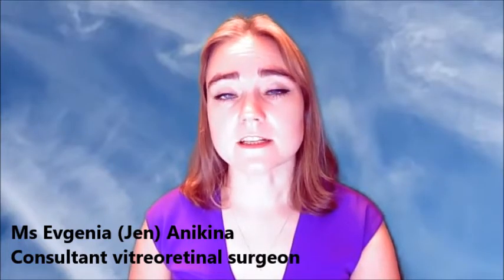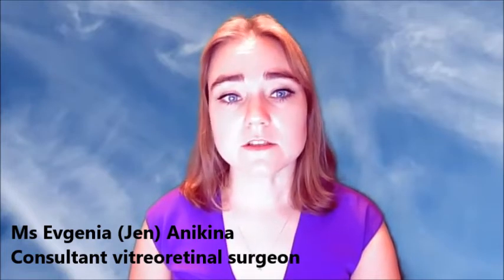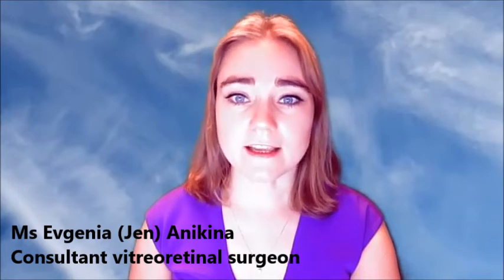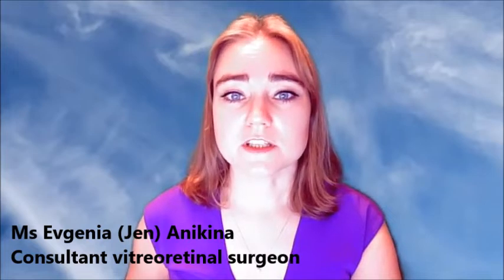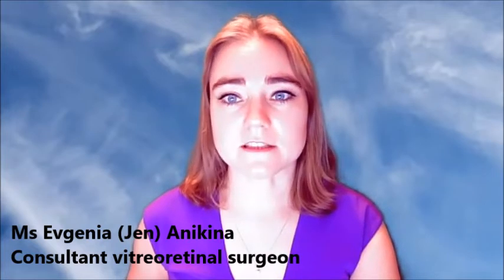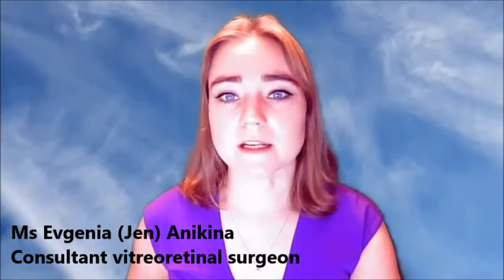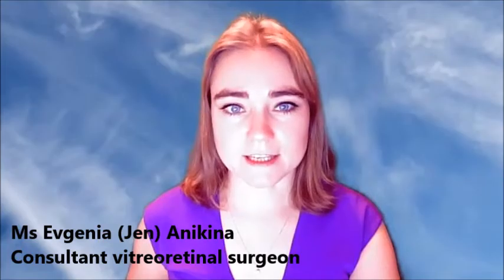Depending on the specific type of implant chosen, surgery may take between 20 minutes to over an hour. In order to perform the operation safely, it may be necessary to carry out a vitrectomy, which is a procedure to remove the vitreous jelly from inside the eye cavity. In case of any surgery, you should remain completely comfortable and pain-free, and you will not see the procedure taking place.